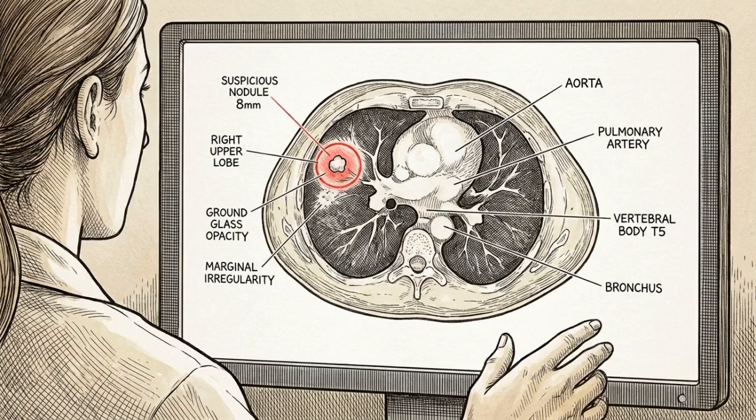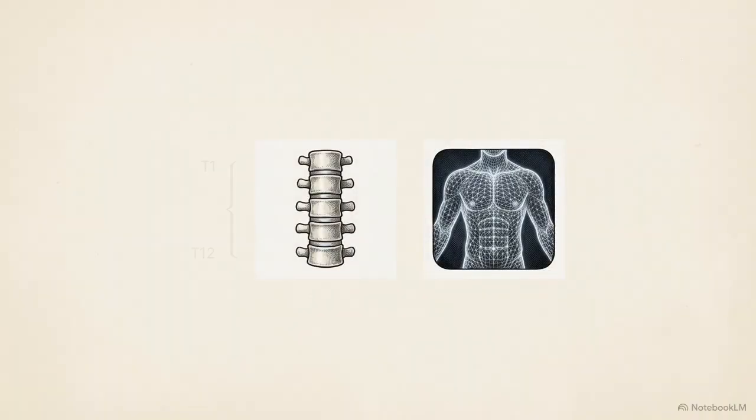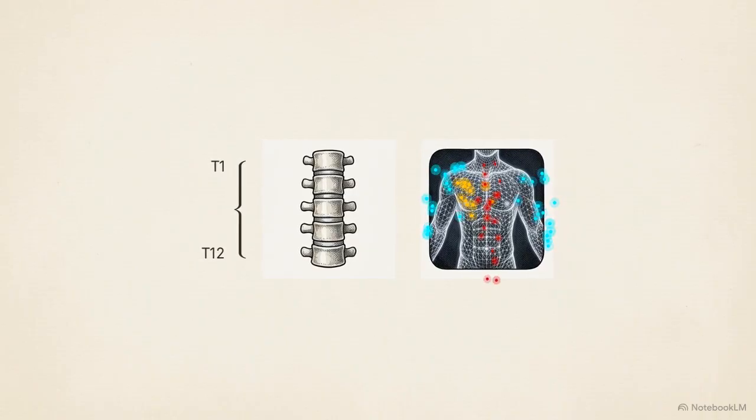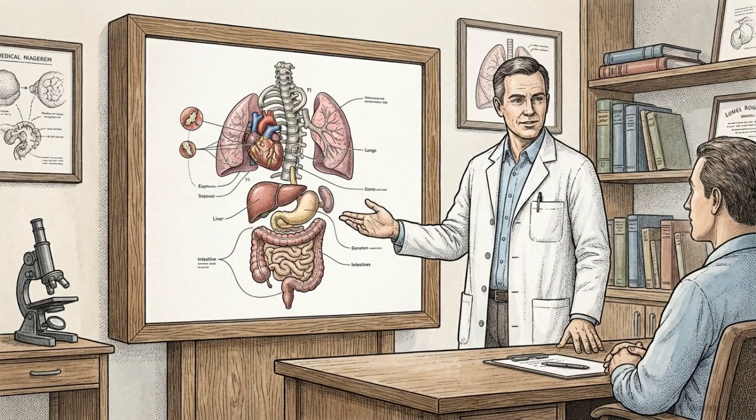Radiologists traditionally interpret these scans exclusively for the primary clinical indication, such as identifying a pulmonary nodule. By confining their analysis to a single, isolated diagnostic question, they leave massive amounts of objective health data entirely unexamined. The anatomical window captured on these scans, extending from the T1 to the T12 vertebrae, contains a dense, latent matrix of cardiovascular, metabolic, and musculoskeletal biomarkers. Extracting this latent data enables proactive primary patient prevention by measuring risks long before they manifest as clinical symptoms.